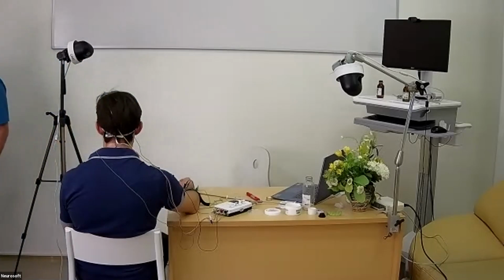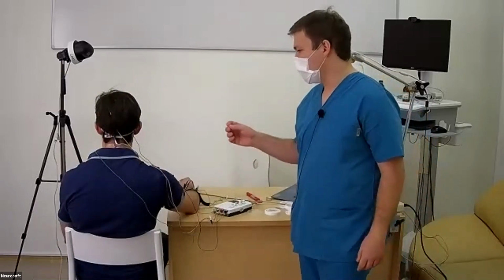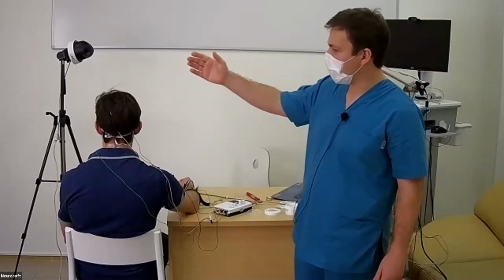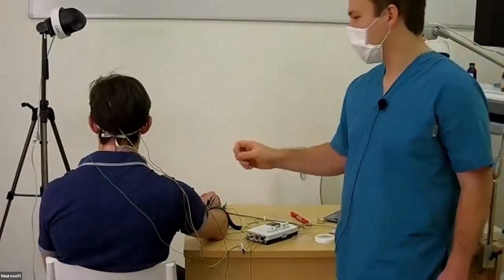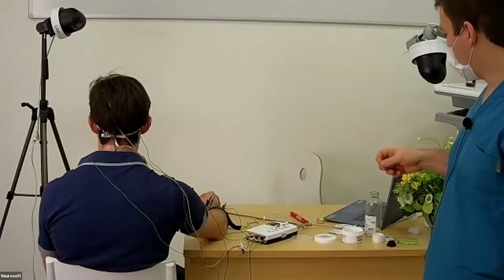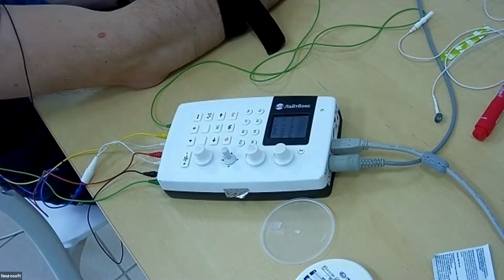Somatosensory evoked potentials are registration of electrical activity from different levels: cortical level, spinal level, and plexus level. We will register three channels of evoked potentials, and for that we will use our 3-channel EMG machine.